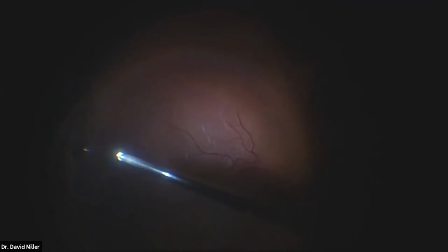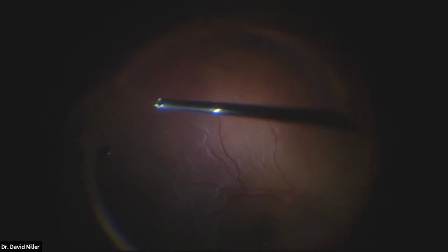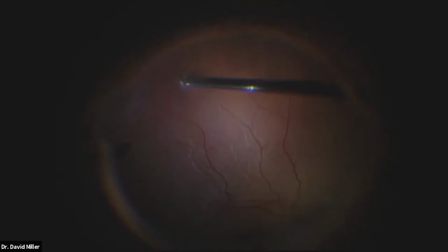And if you have an area that has significant traction, you can always do this under scleral depression. I think just a large core vitrectomy really will get the job done. Okay, so we only found the one area of the retinal breaks that matches with the expectation of where we expect to see it, near the highest 2 clock hours on the higher side. Created, we're going to drain out the retinal detachment.